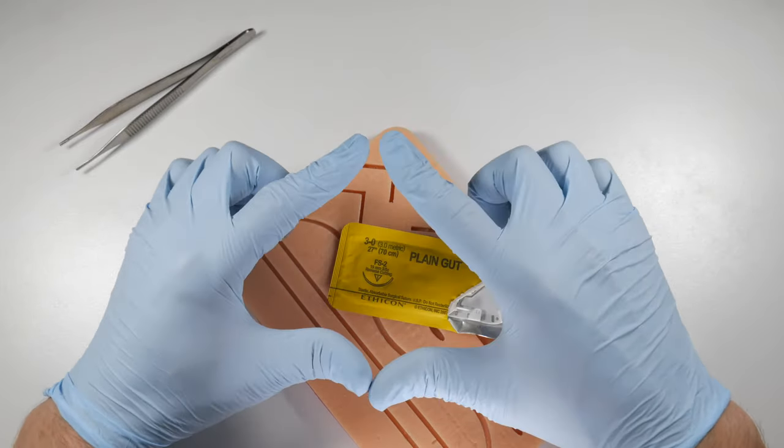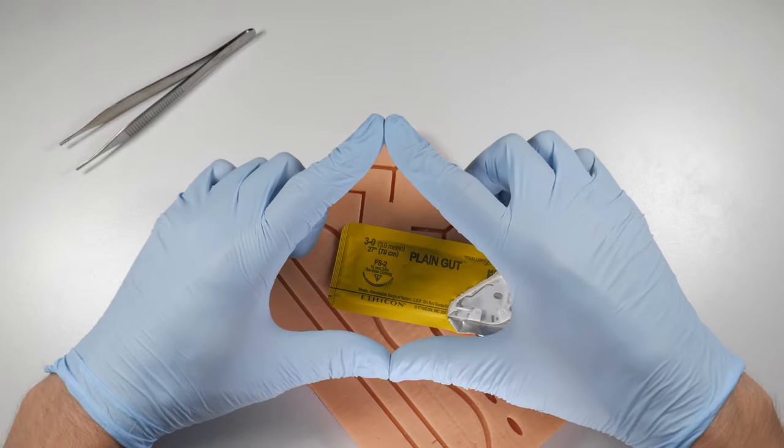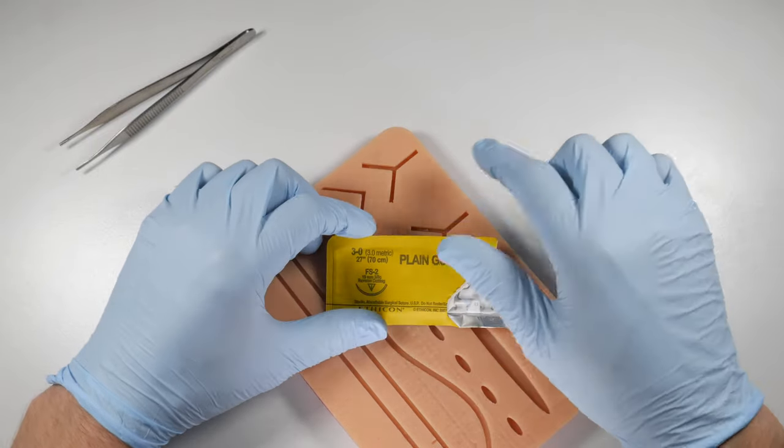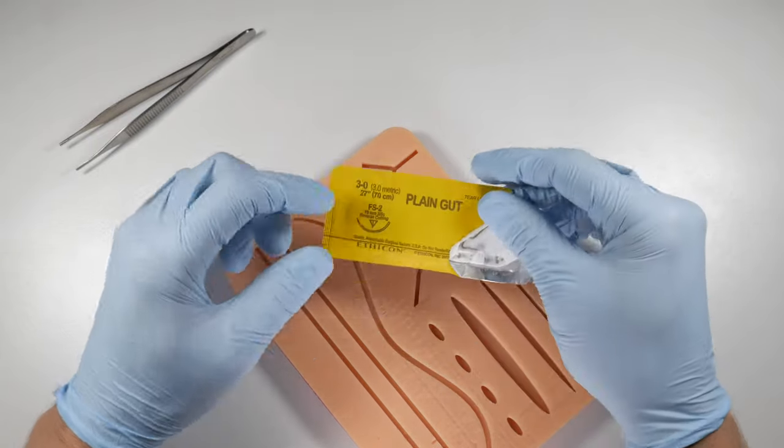A cutting suture needle would have a triangle that's facing the other way. The cutting edge would be on the concave surface of the needle.